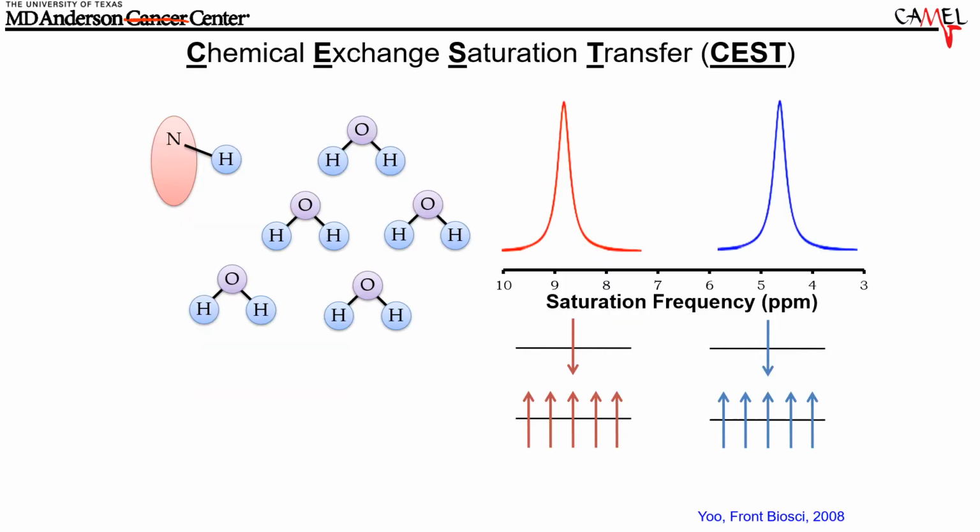Let's move on to chemical exchange saturation transfer, one of my favorite contrast mechanisms. So how does this work? It works with the physical exchange of a hydrogen atom or proton with a proton on water. But first, let's look at the signals from the amide or amine NH protons on proteins relative to the water signal. Or this could be an exogenous contrast agent as well. And so I'm not showing these to scale, but I'm showing that there is a net amount of magnetization pointing with the magnetic field versus that against the magnetic field. This is certainly not to scale, as I've pointed out.